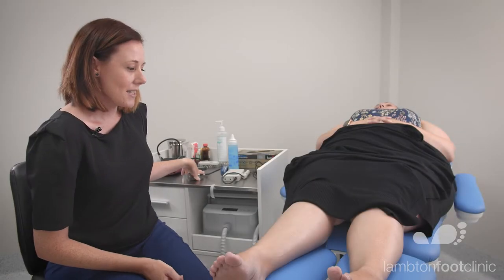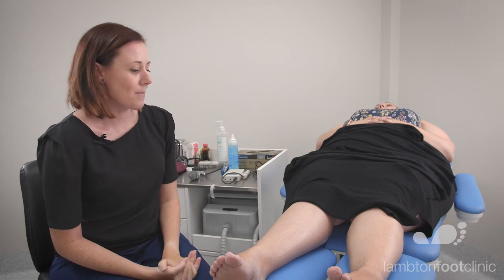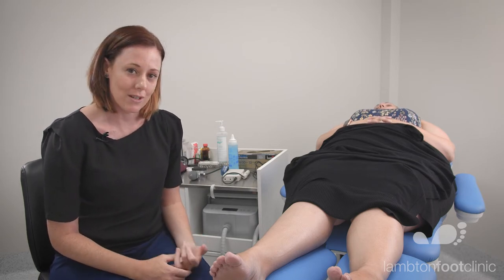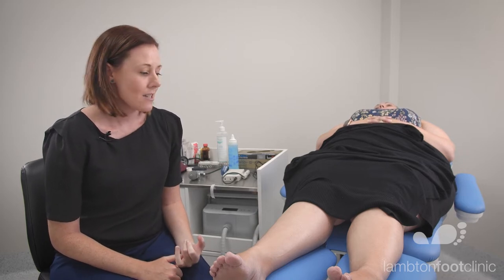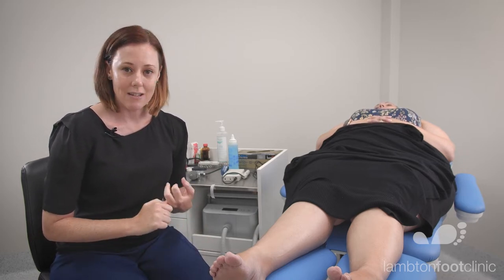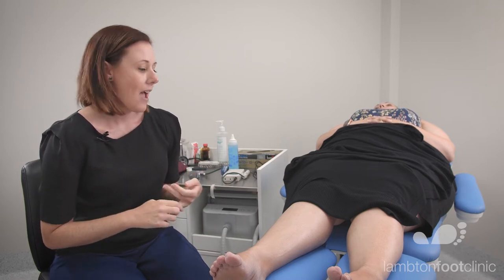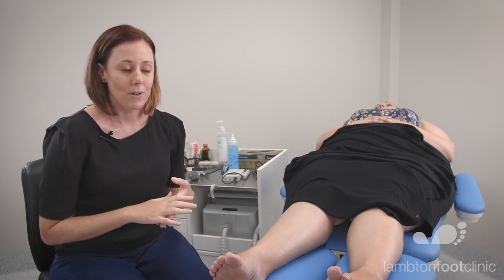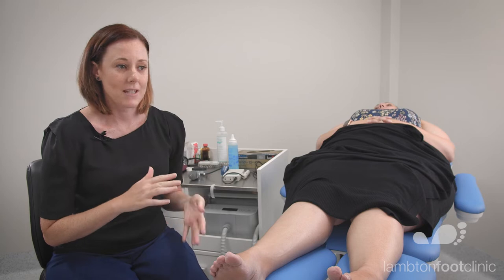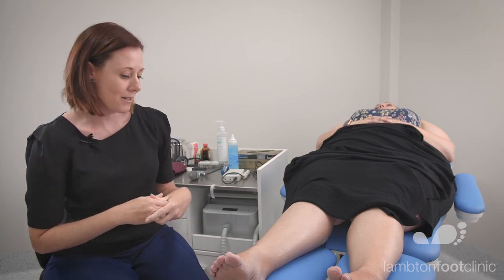So toe pressures can be somewhat fiddly, and you need to make sure that your room temperature is controlled, ideally about 23 degrees Celsius. Your patient needs to be rested for 10 minutes in a supine position prior to taking the measurement, and ideally they have not had any coffee, smoked cigarettes, or participated in any vigorous exercise in the hour leading up to the measurement.